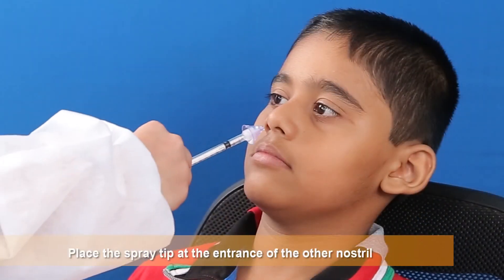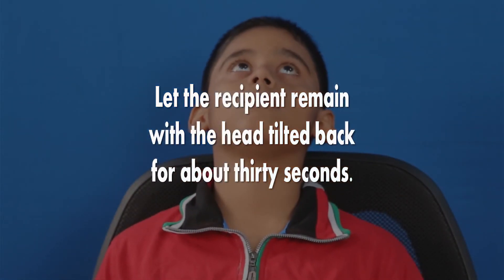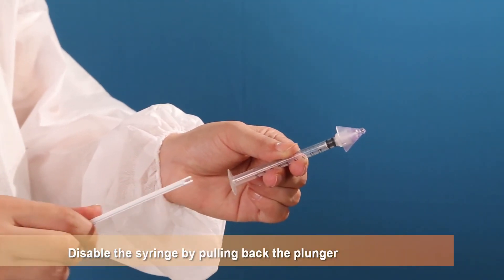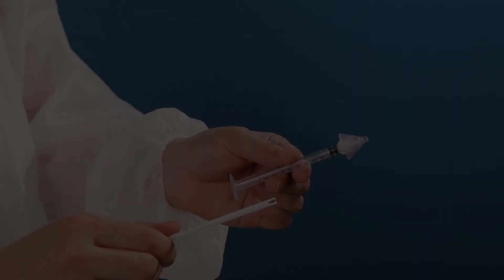Place the spray tip at the entrance of the other nostril. Let the recipient remain with the head tilted back for about 30 seconds. This completes the administration of the entire dose. Disable the syringe by pulling back the plunger to break it off from its tip.